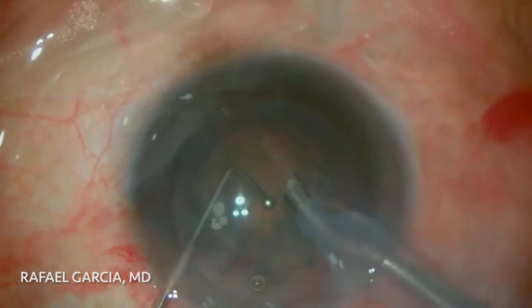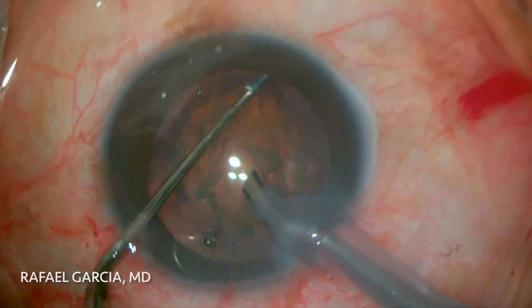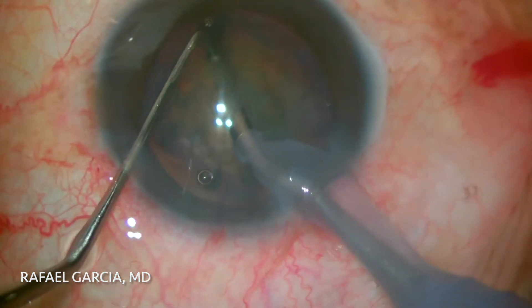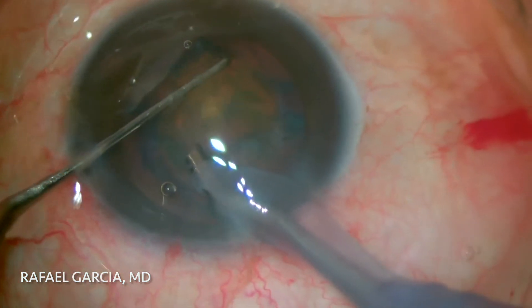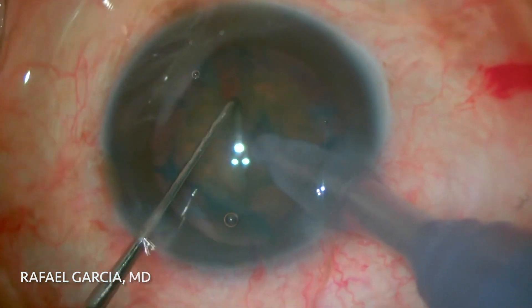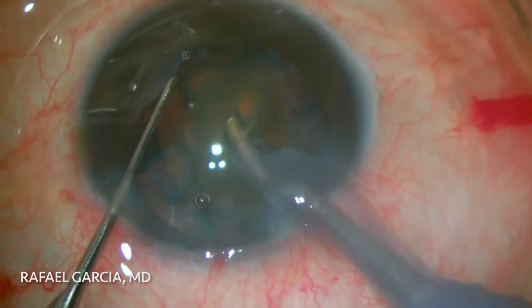Now comes the phaco probe. We like to use this long and blunt chopper to perform our standard horizontal chop maneuvers, because it provides a good hold of the nucleus equator and thus ensures an efficient fracture. After dividing the nucleus into several pieces, the fragments are held with high vacuum and then easily emulsified in the iris plane.